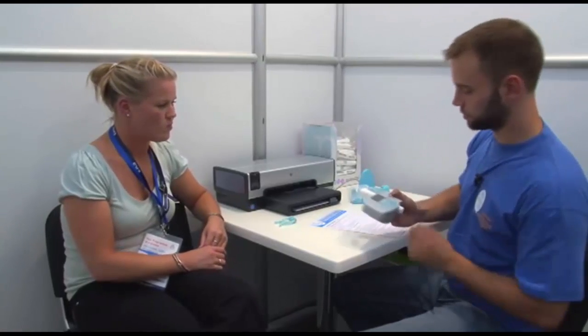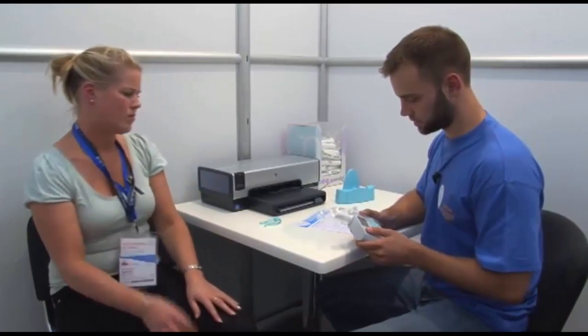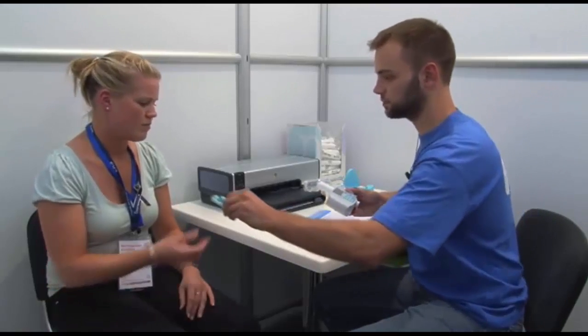At first you take on this nose clip, then I will give you this device. You take it like this, you inhale to the max, then you take the mouthpiece into the mouth, and then you exhale completely. There are two important aspects. Firstly, you have to exhale as fast as possible in the first second, and secondly, you have to exhale completely, so that you make sure to get all the air out of your lung. Okay? I'll support you with this. I'll tell you when to stop, and we approximately have to do it 3 to 4 times. Okay? So put on the nose clip, please.